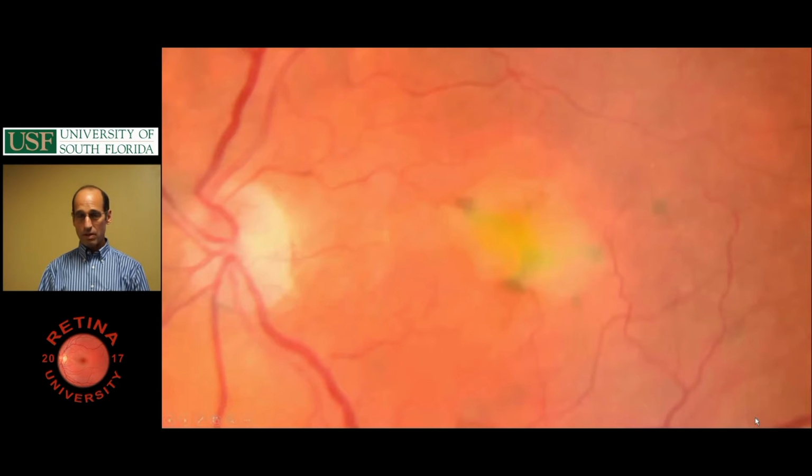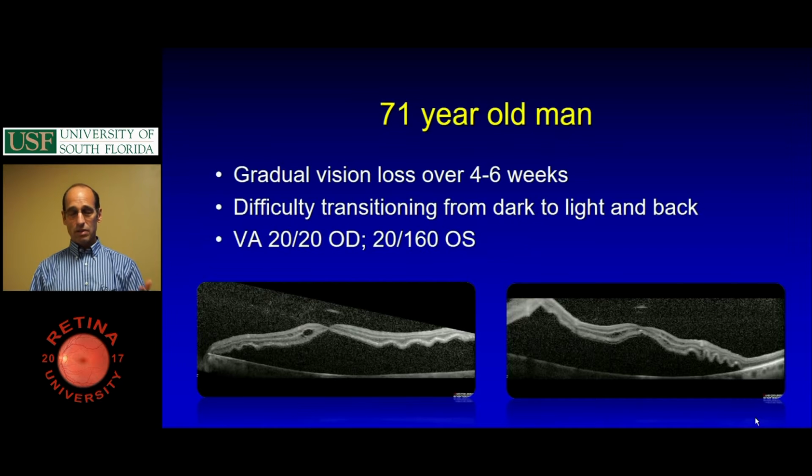And here's a picture. It's a yellow spot under the fovea, and this is a pattern dystrophy. It's a very common subretinal fluid mimic, and some of the pattern dystrophies will look dark, so they'll have frank fluid. We showed a case a couple months ago where they actually had a fluid level in the pattern dystrophy. So the pattern dystrophies can look like subretinal fluid. It's probably not exactly fluid, it's probably more hyporeflective material.